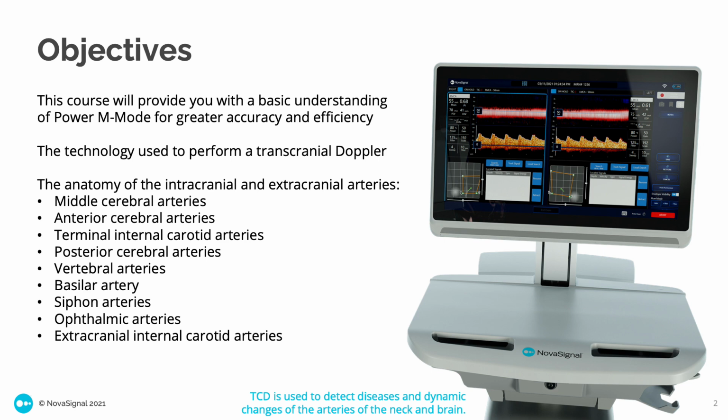This course will provide you with a basic understanding of Power M Mode for greater accuracy and efficiency. The technology we use to perform a transcranial Doppler exam is demonstrated on the right here. It's our NG2 robotic transcranial Doppler system.